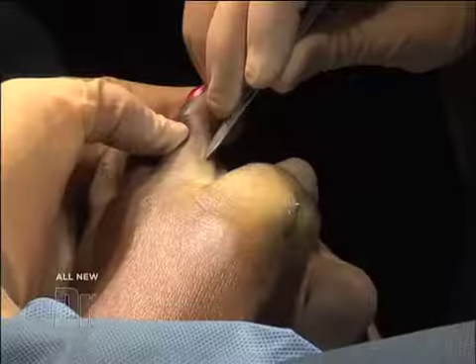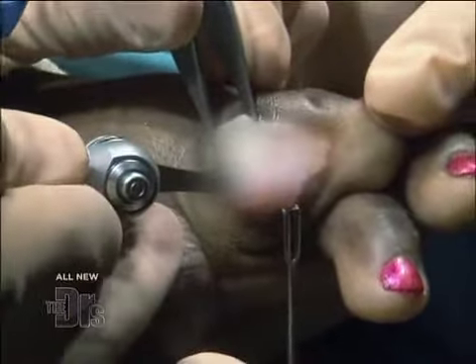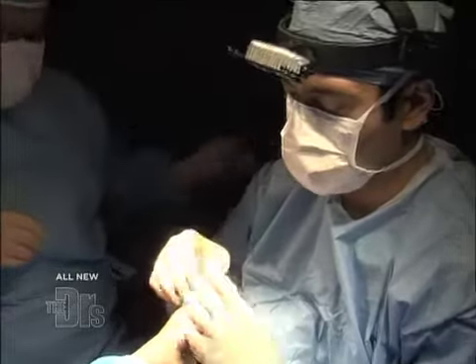So you put the incision directly in the middle. We're going to dislocate the toe, and there it is. You can see the joint. So what we're going to do is remove the head of the joint. There it is. Now let's get ready for placing this implant.